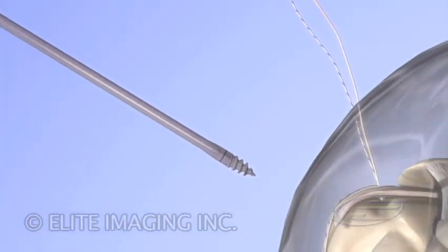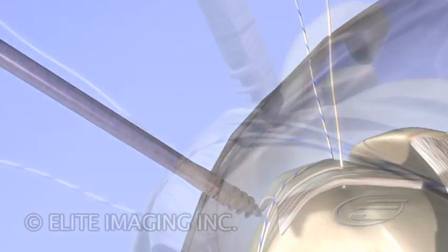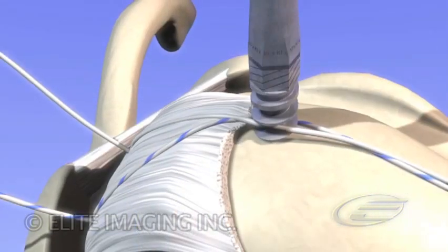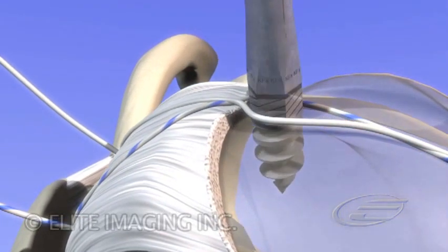Now the lateral anchor and second point of fixation is placed percutaneously. Before the lateral anchor is seated, its tip is used to position sutures in a crossing pattern. The anchor is self-tapping, and depth markings indicate how far to seat the screw.